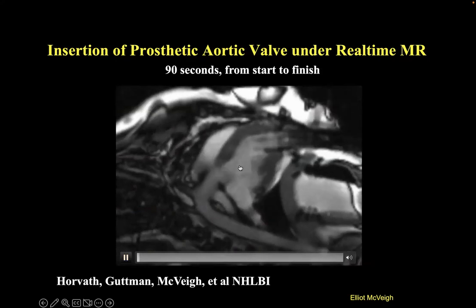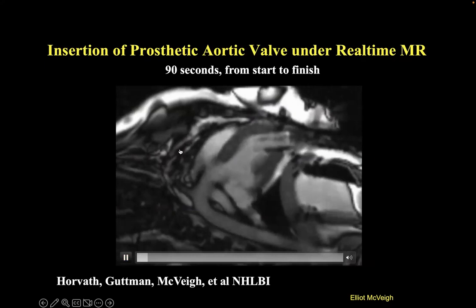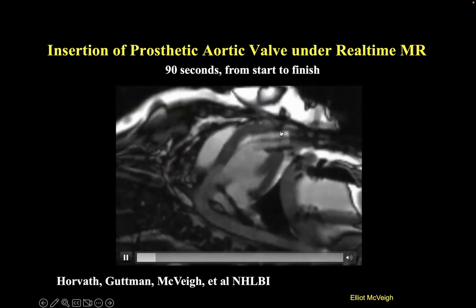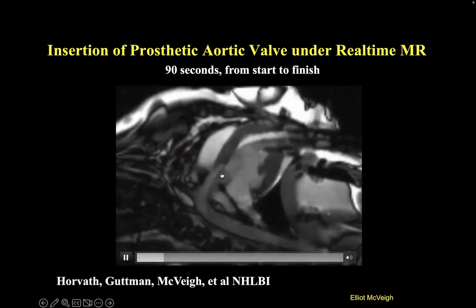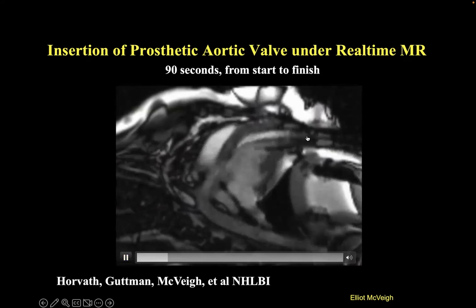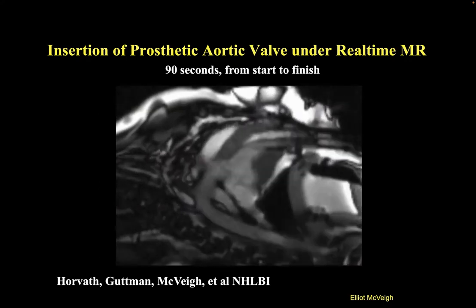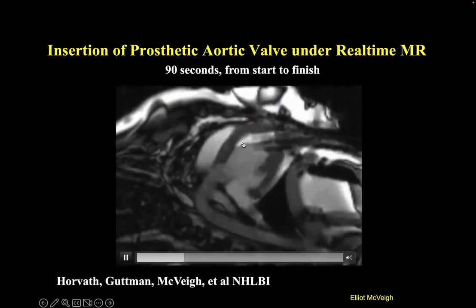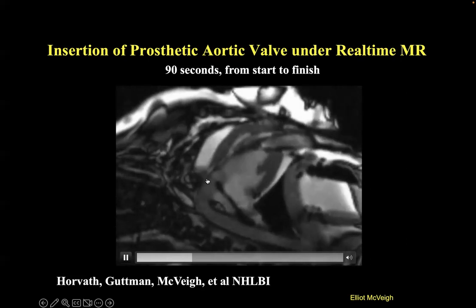The other thing we did, this was with a cardiac surgeon, is on a porcine heart. We've come through the chest wall and put a trocar into the apex of the heart. This is basically a guide wire on the apex, which we push into the ventricular chamber. The guide wire itself you can see just as a reduction in signal.